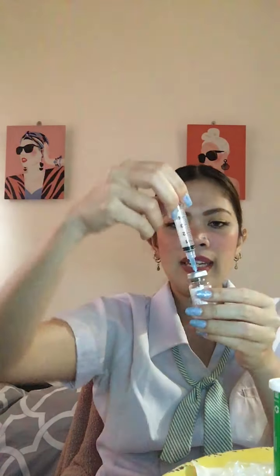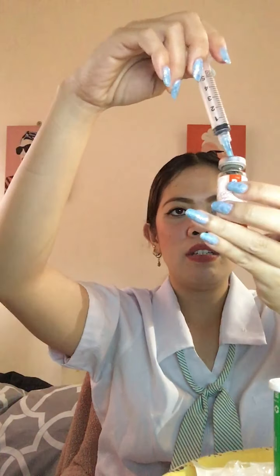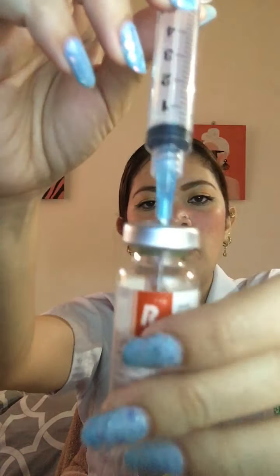And then withdraw the amount of drug required for the dosage. It has to be the required amount. For this one, see, the needle is too far from the medication.